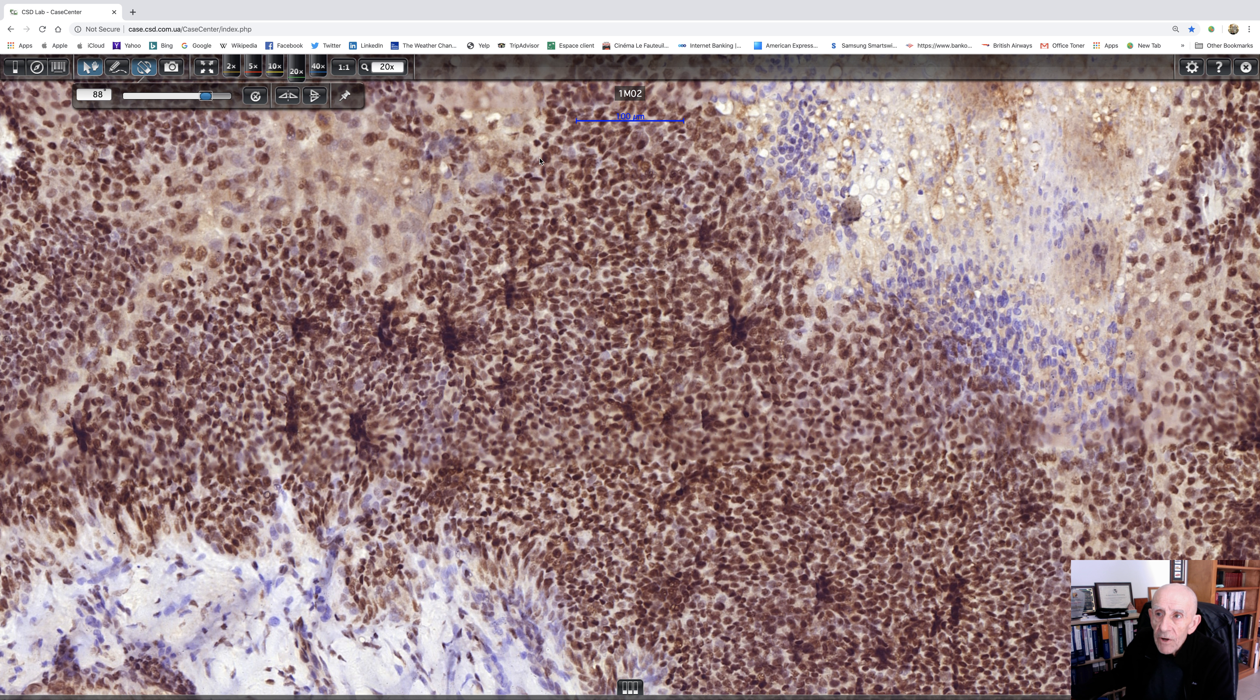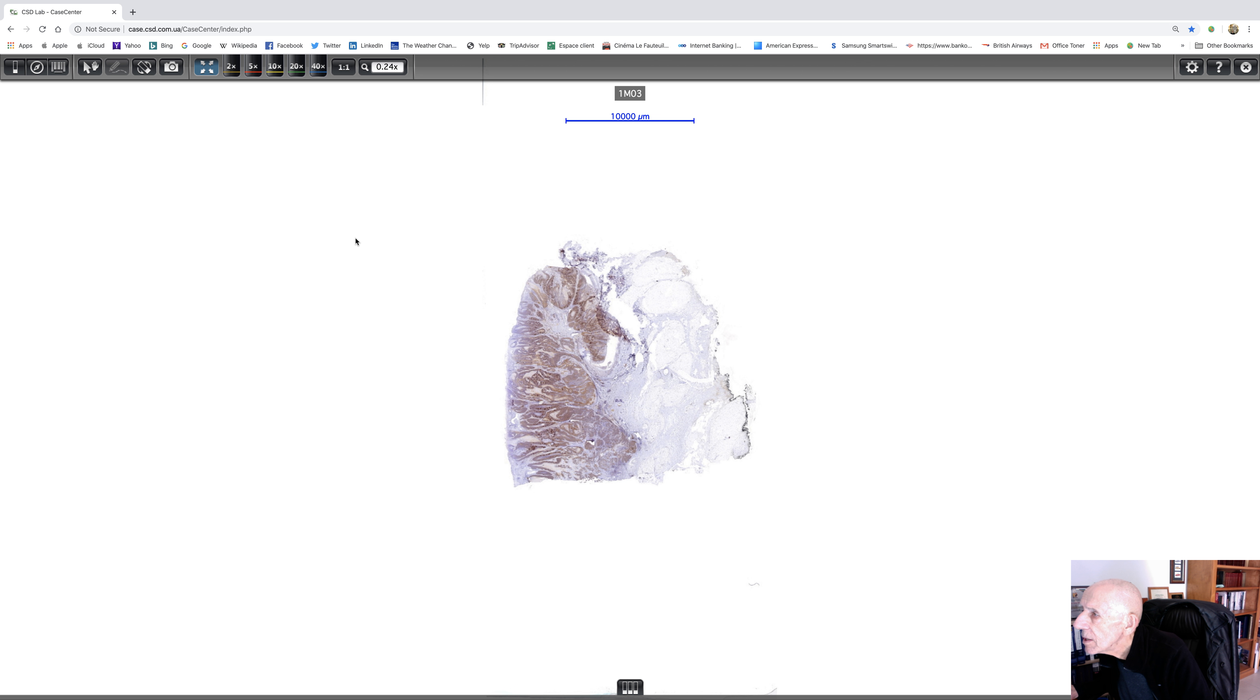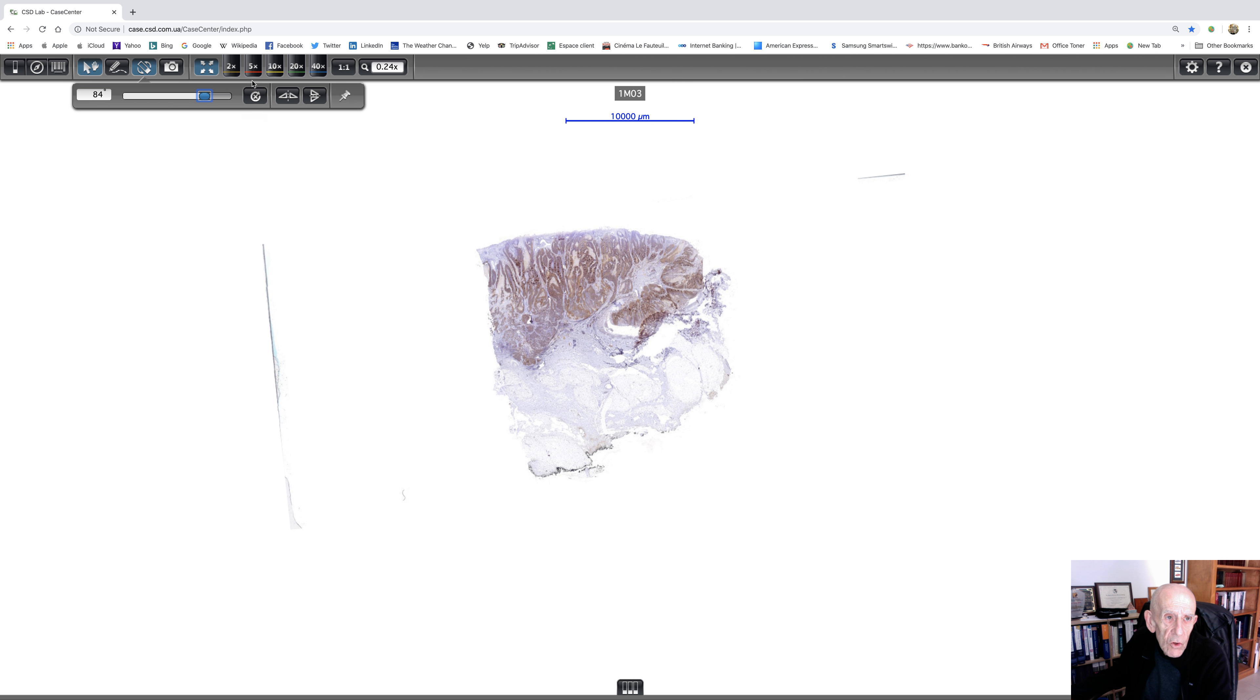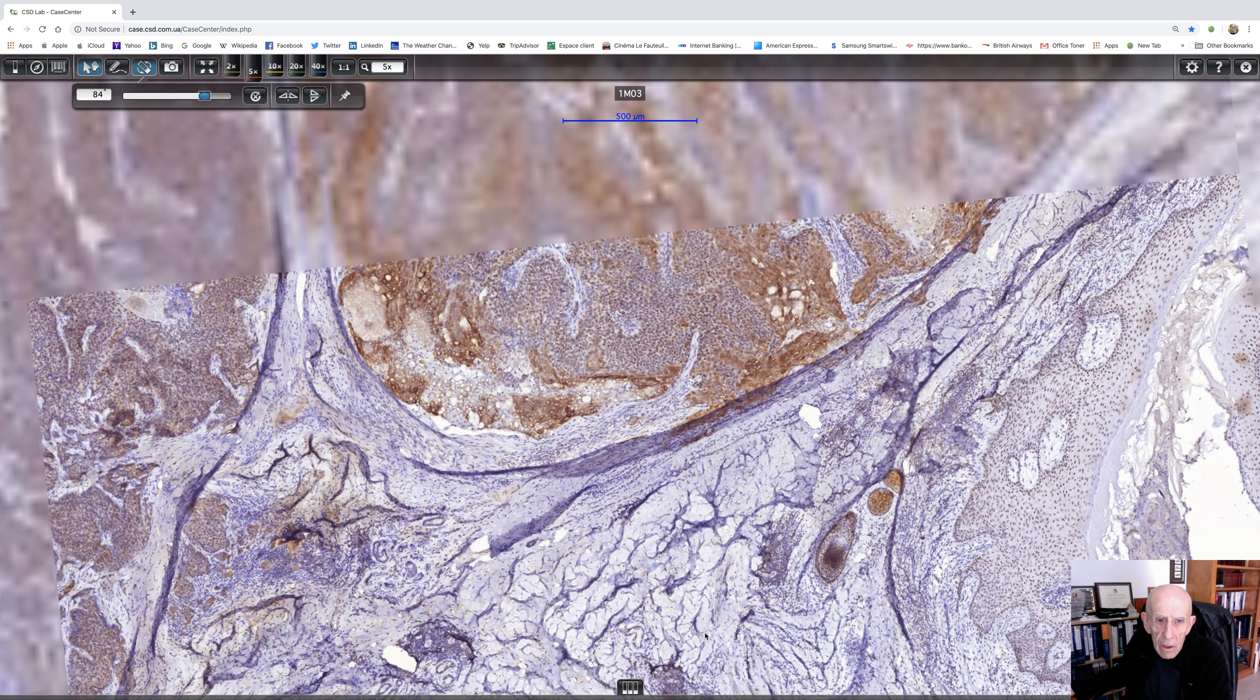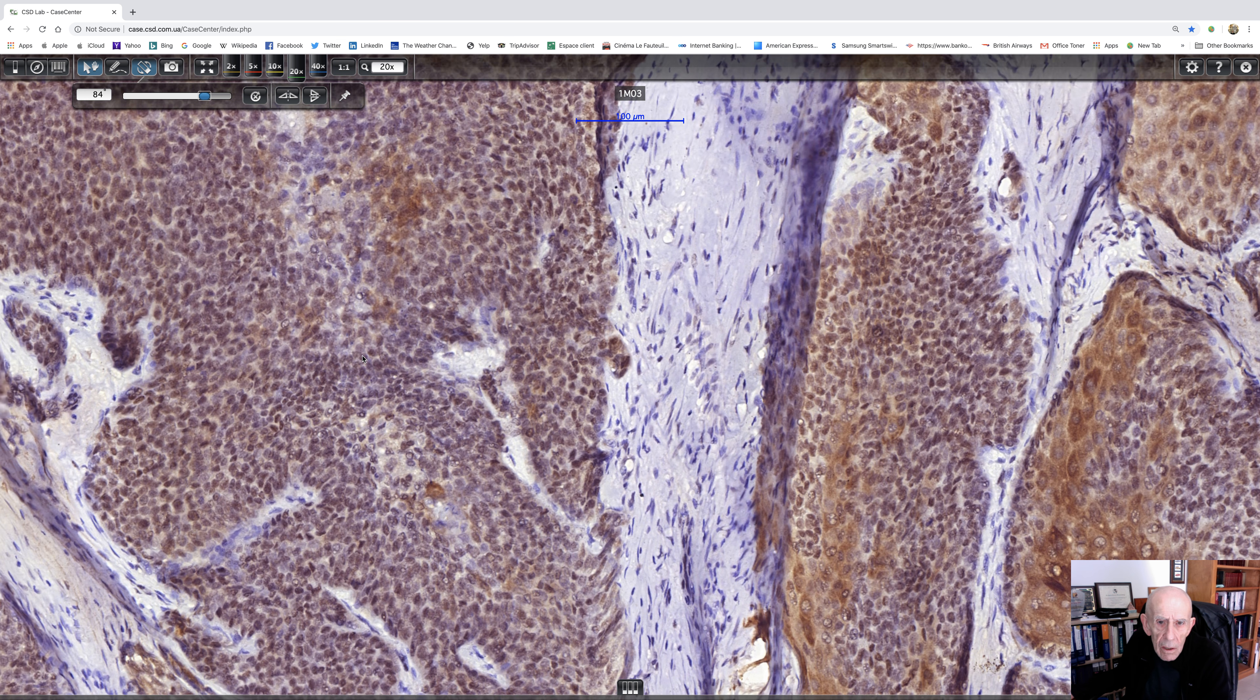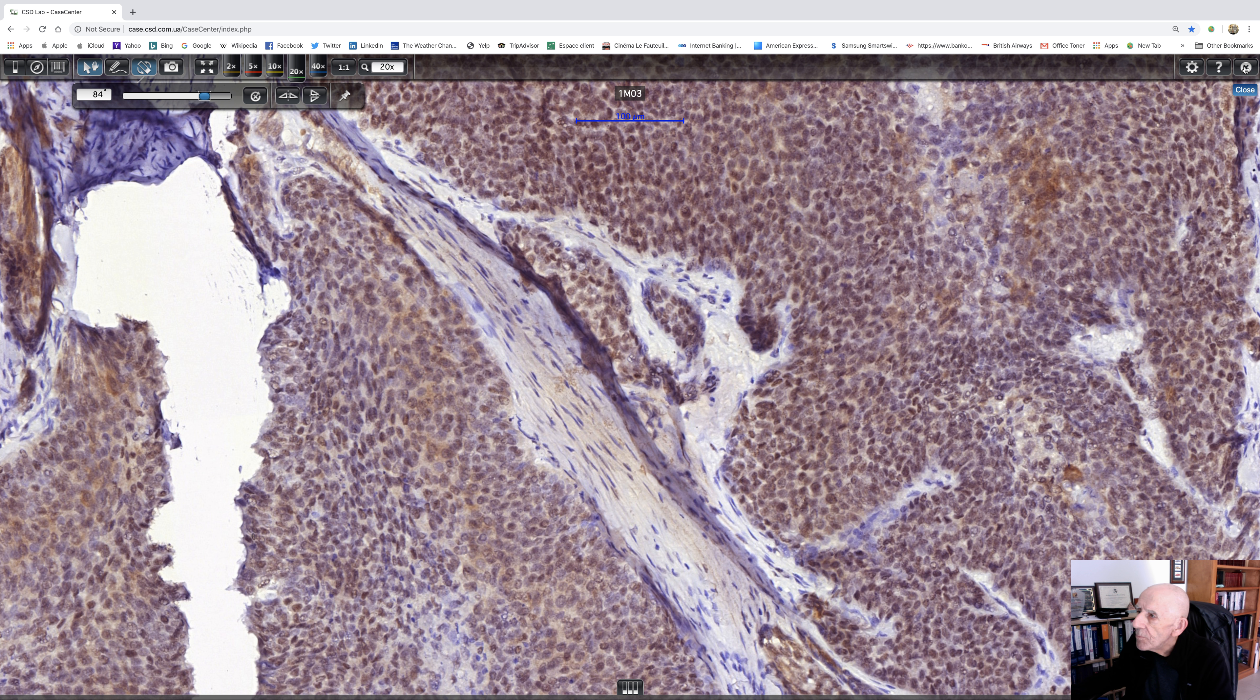So we can forget about that. What's the next one we've got? This is PMS2. There we are there. I'm just checking with my screenshot of what these are. Yes, this is PMS2. And we'll straighten that one up. And it looks to me as if that one's going to be strikingly positive too. Oh, that's looking pretty good. Let's put this at higher magnification. Yes, so that is normal. So there's no loss of that gene expression.